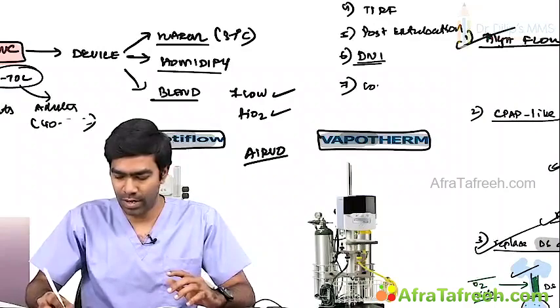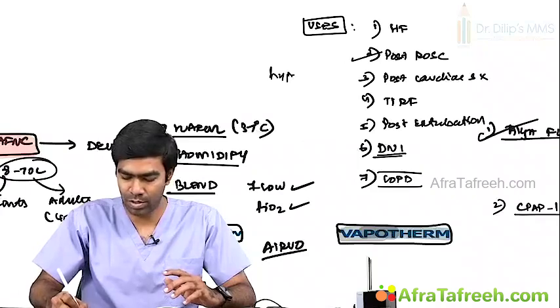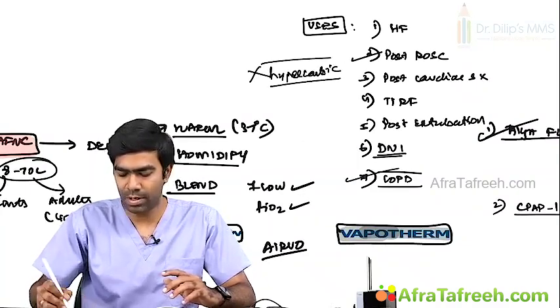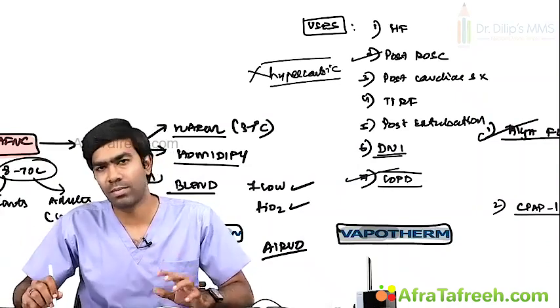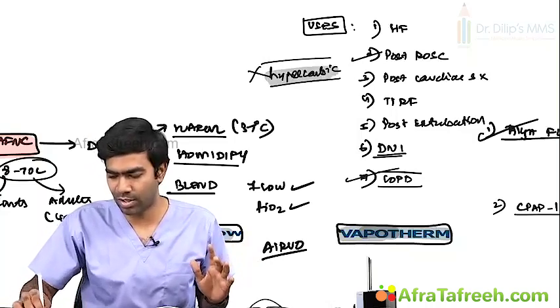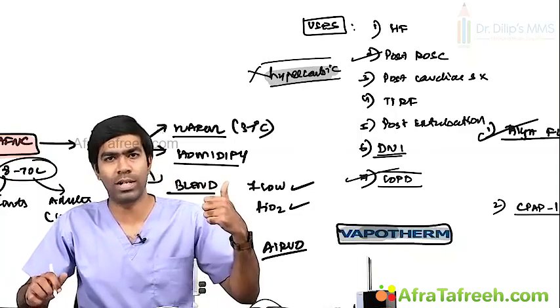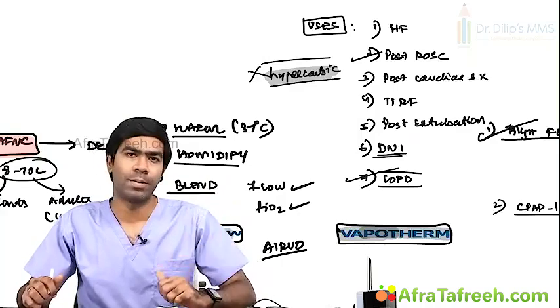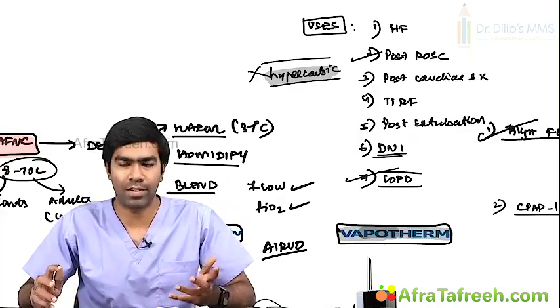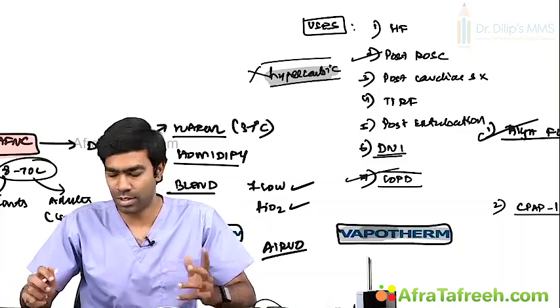And the COPD, be very, very cautious, because such a high flow of oxygen cannot be used in hypercarbic states. In COPD patients who are not hypercarbic, you can use this HFNC, but with excessive CO2, if PaCO2 is very high, it's really, really dangerous. Such a high flow can worsen the CO2 retention. I told you in the COPD chapter itself, where there are a lot of problems. Clear? Because of the Haldane effect and VQ mismatching, you might get some progressive CO2 retention, and more problems.